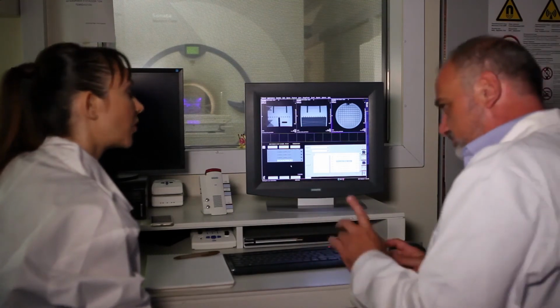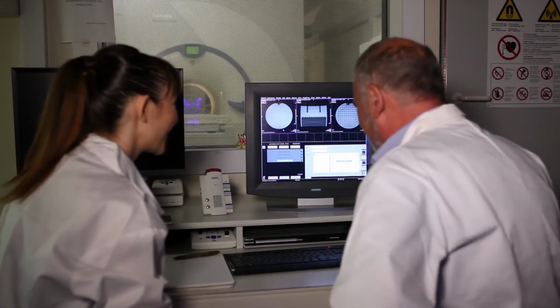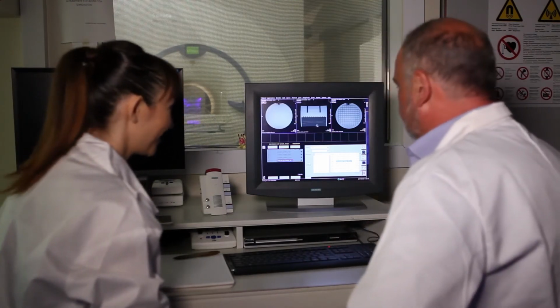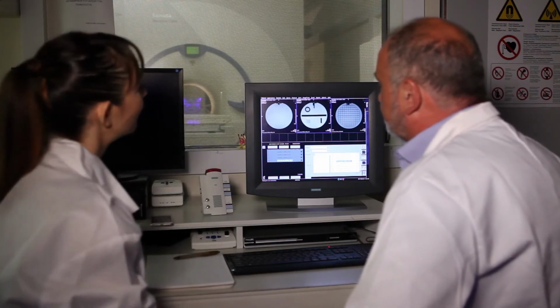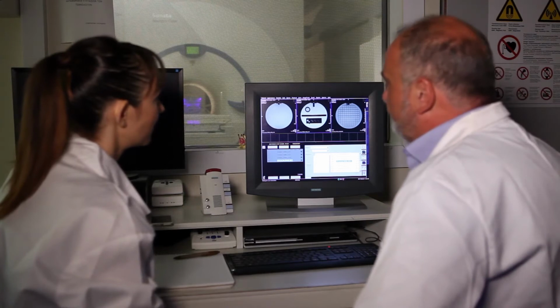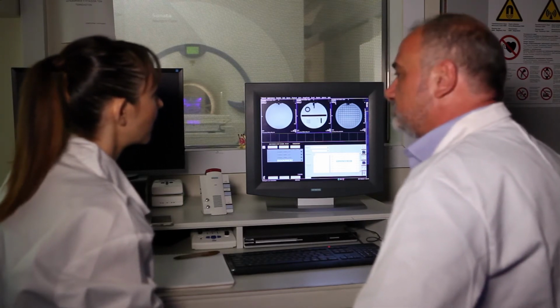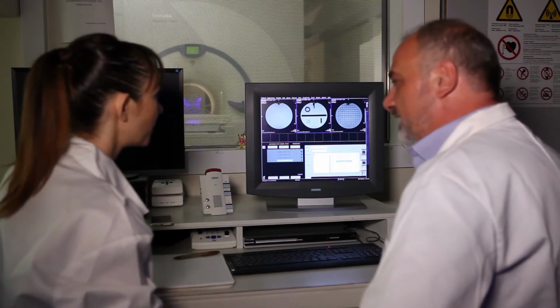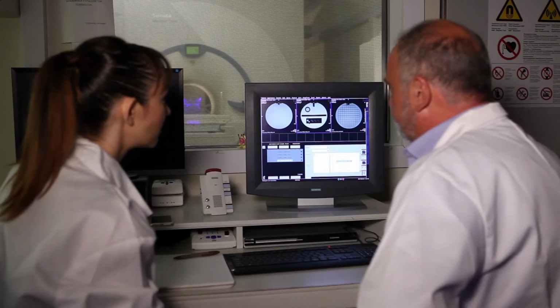You give the definition. Let's see what we did. Okay, that's a nice image. Then you're going to see the whole image. We start with this. Perfect. See the two lines here. If there was a problem with the lasers, this would look different, meaning the lasers were not appropriately calibrated. This means that in our system, the lasers are okay.